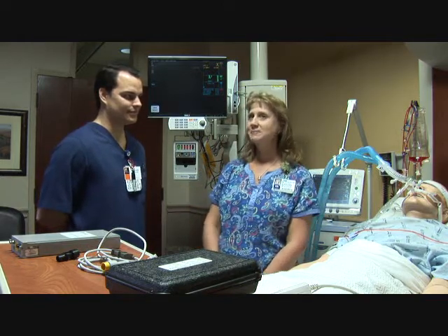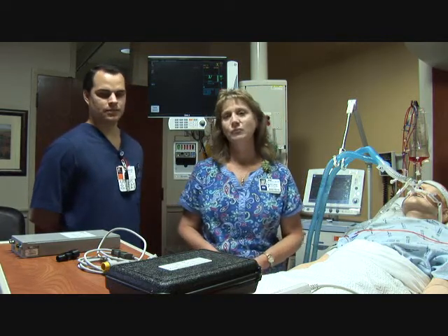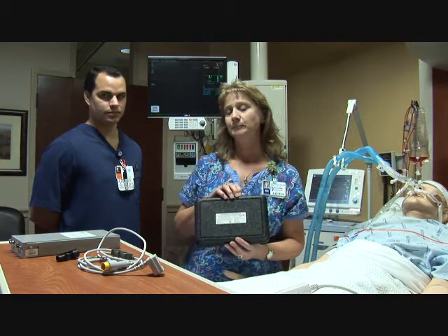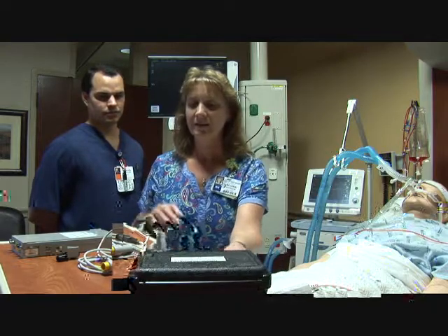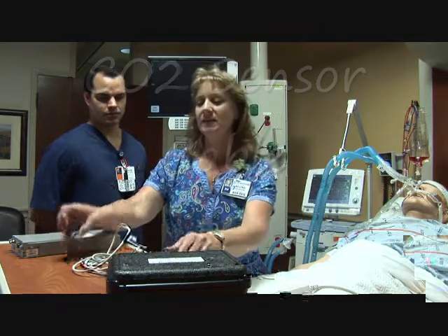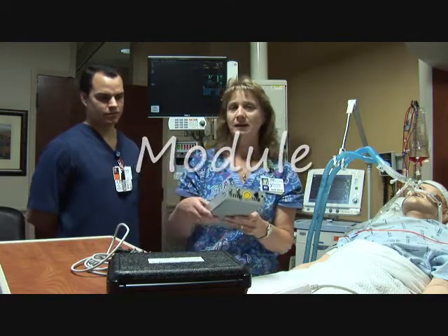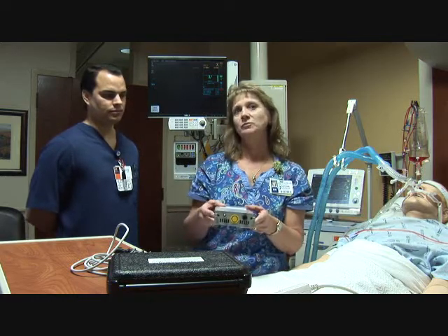So it takes a little bit of time to get everything started, but first of all, I wanted to let you know what equipment we use for that and where it's kept in our unit. We use the Capnostat CO2 sensor, and it comes in the black box, and we keep that at Harris Southwest in the clean utility room. In that box, we have the CO2 sensor cable, and then we also have the analyzer, and the module is kept to the side of that because it's just a standalone and it goes from room to room.